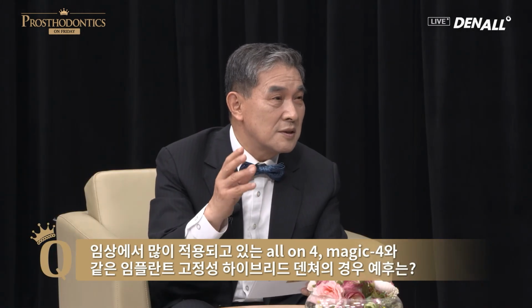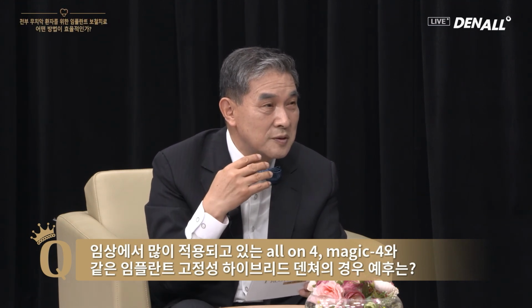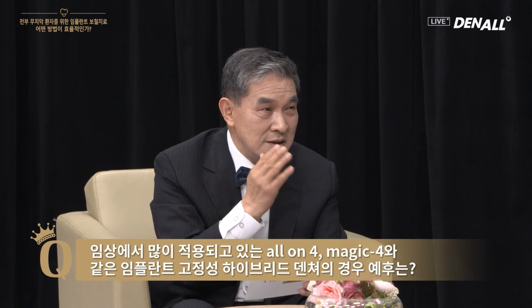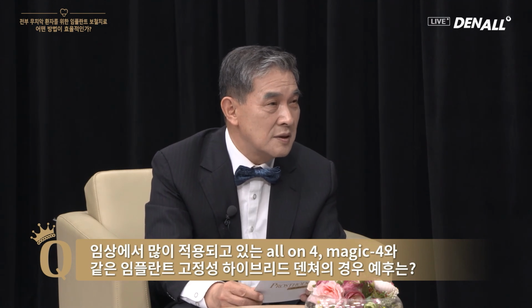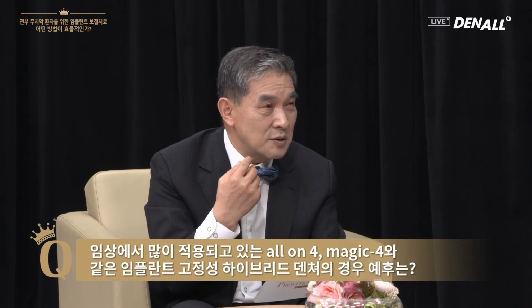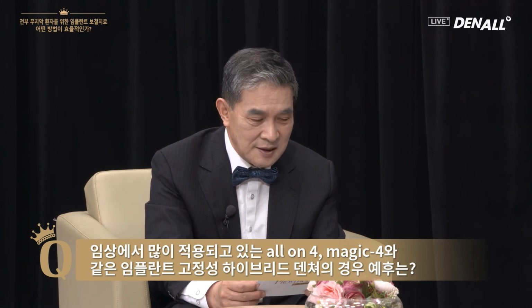In my opinion, in the case of All-on-4, you need to consider what the antagonist is like. You don't really do All-on-4 on the upper, you do it on the lower. You would place the implants in an angled manner like this. If the antagonist is a full denture and the masticatory force is not that strong, it's possible. But if it is sound and there is a strong masticatory force, you need to be careful.